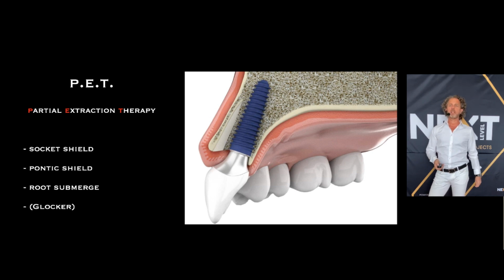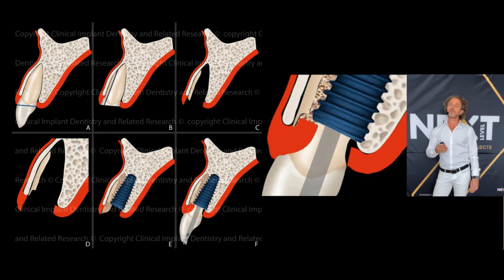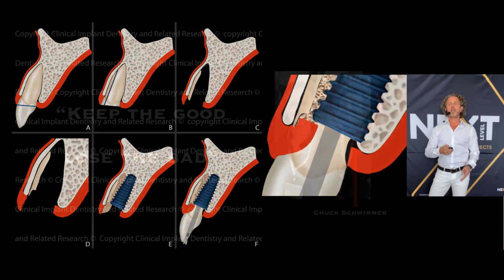But how does this concept go on? The sketch shows us how the step-by-step procedures lead us to an immediate implant placement with shield protection of the cortical plate. So first we remove the coronal portion of the whole hopeless tooth. Then we dissect from mesial to distal, remove the palatal portion, shape the shield, place an implant to the crest level, and whenever possible we temporize it. Why? Because this is the concept of the dual zone therapy.